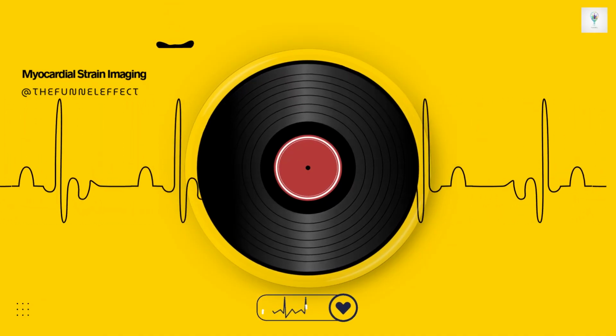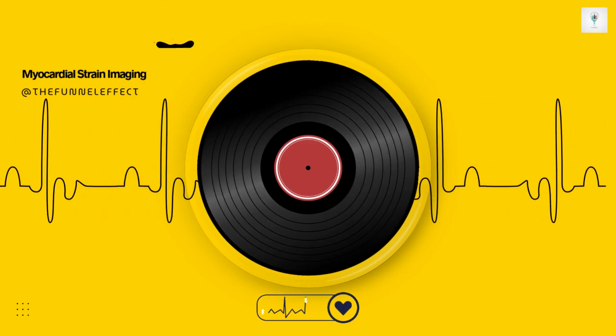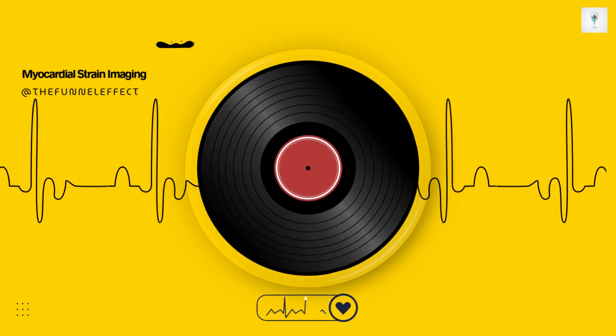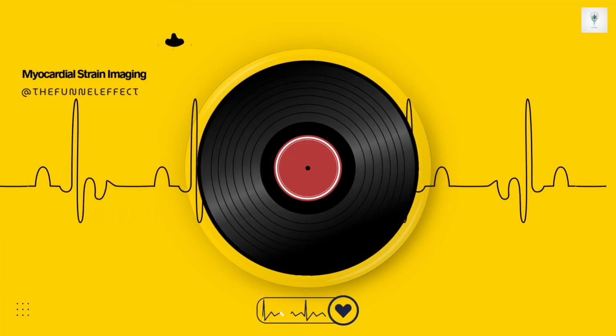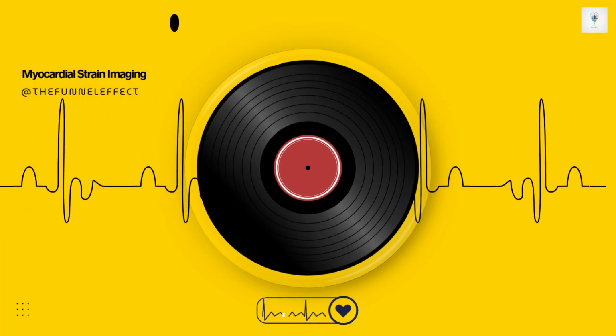Okay, let's cover the other main pumping chamber. The right ventricle, or RV. Imaging and assessing the RV is notoriously difficult, right? It really is. The RV has a complex crescent shape. It wraps around the LV, and its free wall is incredibly thin, typically only 3 to 5 millimeters thick. So getting good strain measurements is tough.